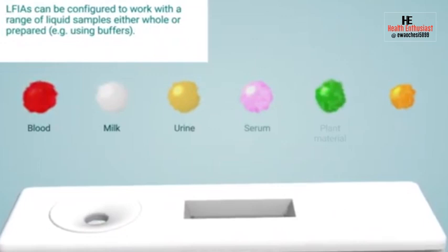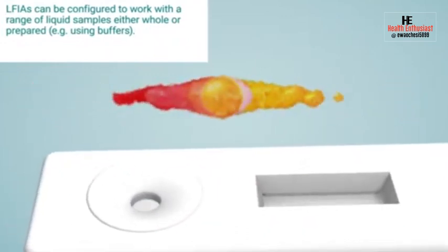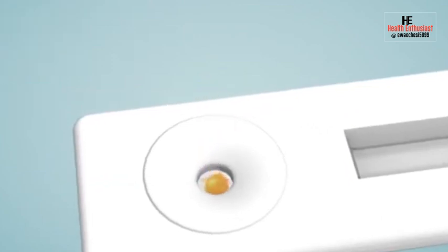Very simple. A liquid sample, maybe blood, urine, saliva, or serum, flows across a paper-like strip, right? On this strip, we have antibodies or antigens already fixed in place. These capture and reveal whether the target we are looking for, what we call the analyte, is present or absent.